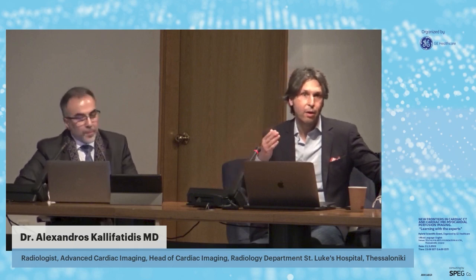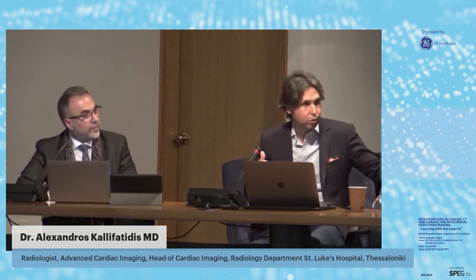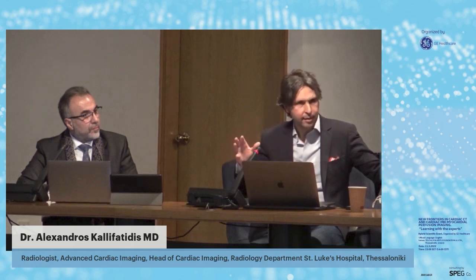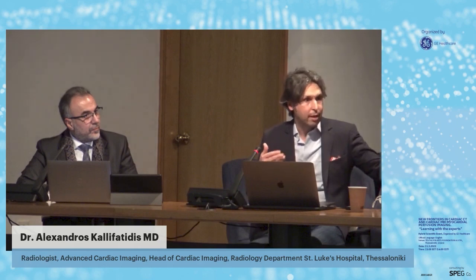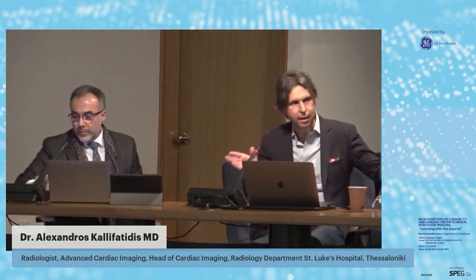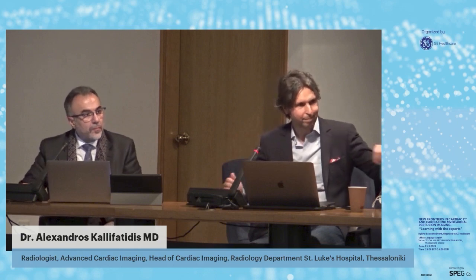You can see it also in stress and rest. On the other hand, a true perfusion defect is much wider. It could be subendocardial or transmural, and you can see it only in stress and in a coronary territory. So it needs experience. The more examinations you see, the more familiar you are with this artifact, and you can discriminate and say, okay, this is a dark rim artifact and not a true perfusion defect.